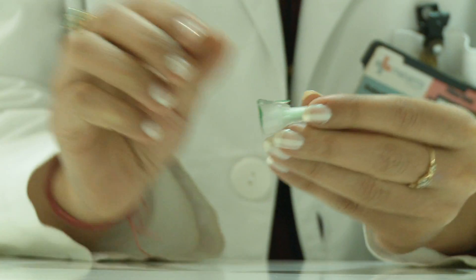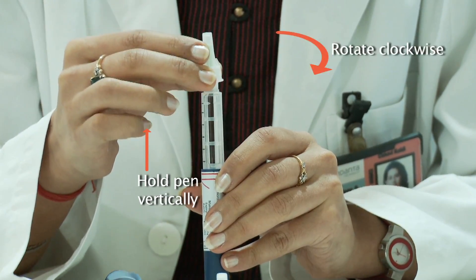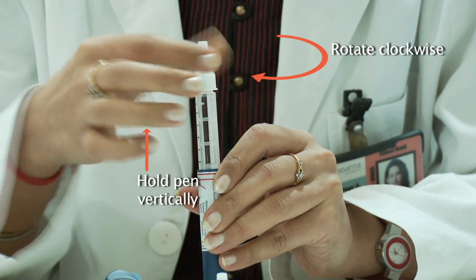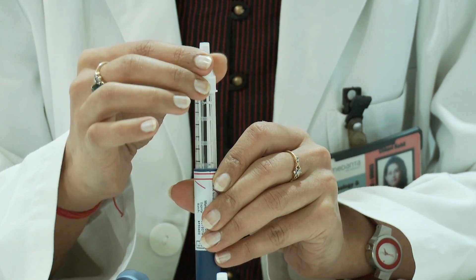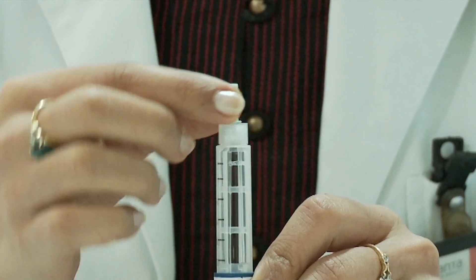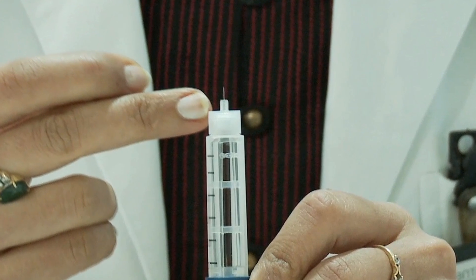To fix the needle, remove the paper cover. Fix the needle straight on top and rotate it in the clockwise direction till the needle is attached firmly. Remove the outer cover. This is the actual needle that goes into the subcutaneous tissue.